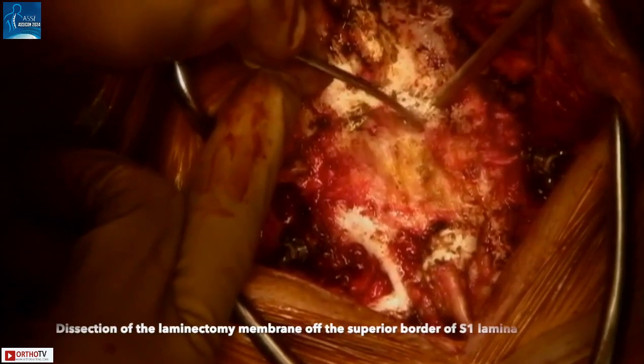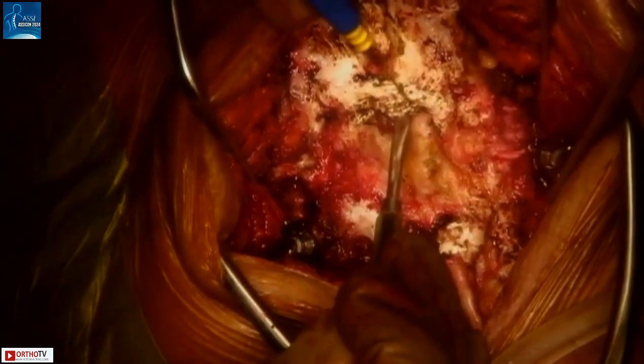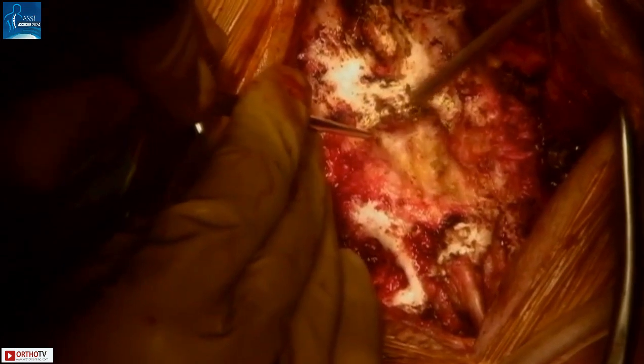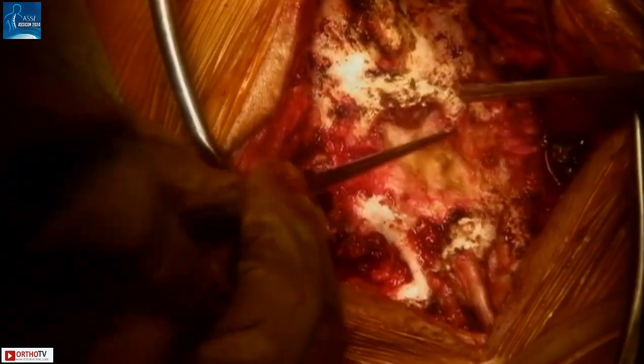Next, the laminectomy membrane was carefully dissected off the superior border of the S1 lamina, using a combination of sharp and blunt dissection. A 3-0 angled curette is used to gently detach the scar from the edge of the bone. This has to be done extremely carefully so as not to damage the dura, which is just underneath. This area is notorious for dural adhesions, and extra precaution must be taken. Using a Woodson elevator, one can confirm that the dura has been adequately separated off the bone so that the next step can proceed.